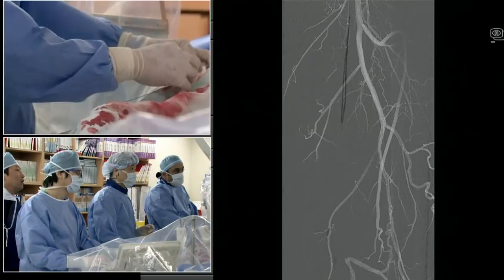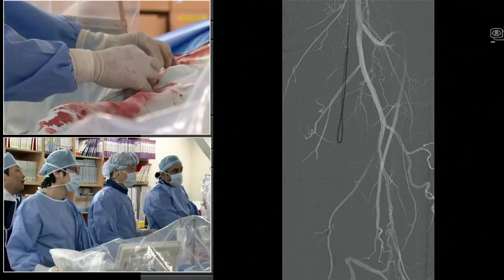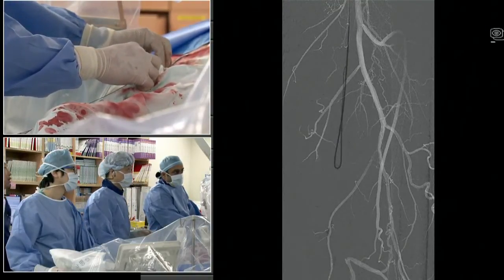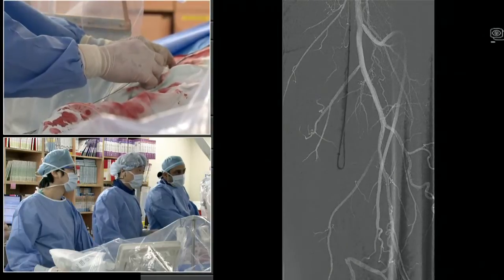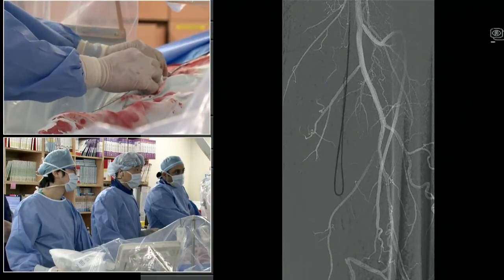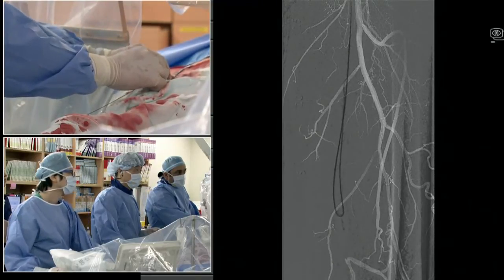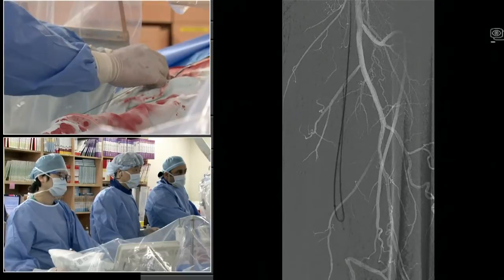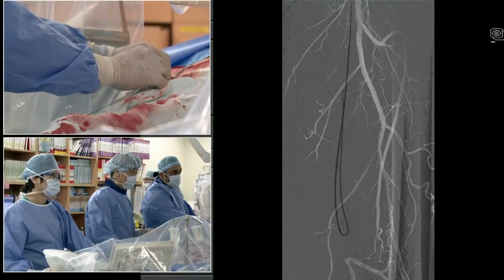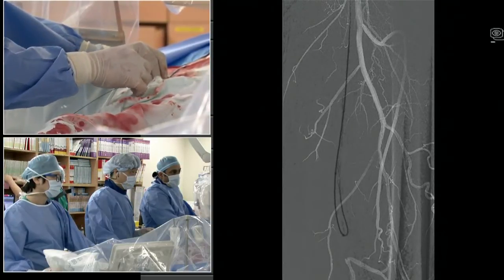Yeah, absolutely. That's why I think everybody's been commenting on moving away from the stem to stern stenting strategy, because you get great results. You feel good when the procedure is done acutely, but 6-7 months down the line, not so much. It's getting a little bit wide here, but I'm going to keep going because it's going pretty smoothly. As I get about 2 centimeters above this reconstitution point, I'm going to take the J away and try to see if I can get it.